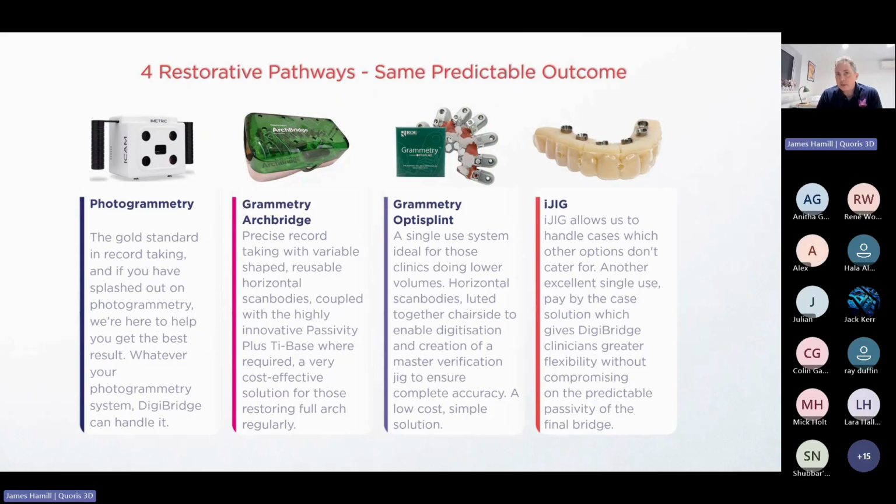Okay. It's typically used in high volume clinics because it is expensive to get invested into, but please remember that it's not without its problems. Okay, it's as good as the operator and it's as good as the lab that's handling the data sets. So if you've splashed out on a photogrammetry kit, then there's no question that DigiBridge will work for you. It's certainly one of the workflows. But photogrammetry isn't accessible to the vast majority of dental practices.